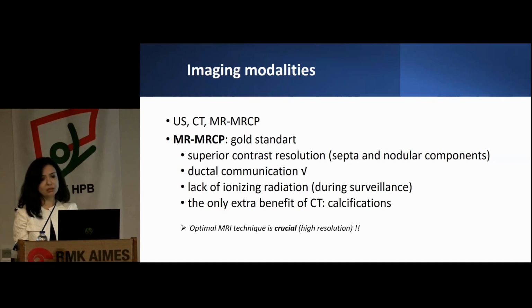I won't go into detail, but optimal MRI technique is a must. If MRI cannot be performed for some reason, such as a contraindication, then radiologists should use curved multiplanar reformat images to find out the presence or absence of ductal communication.